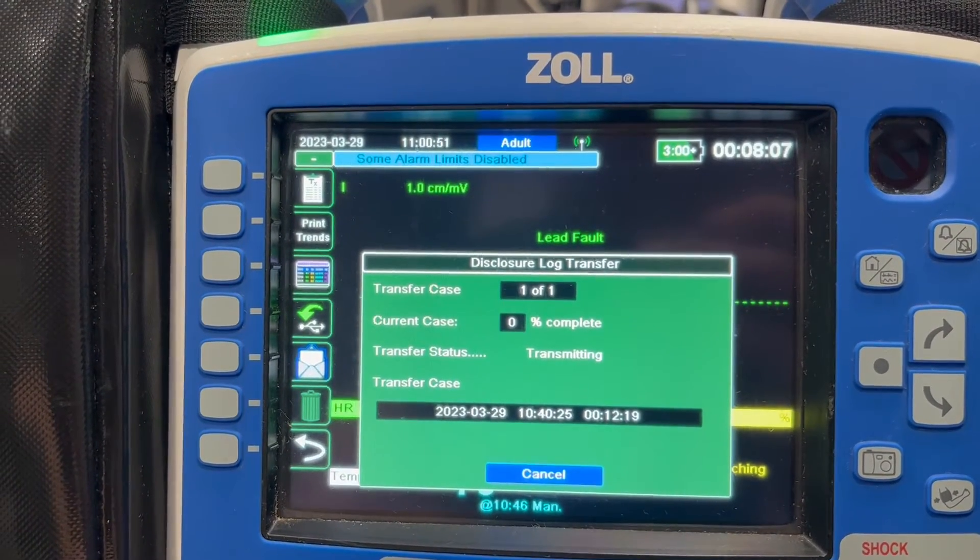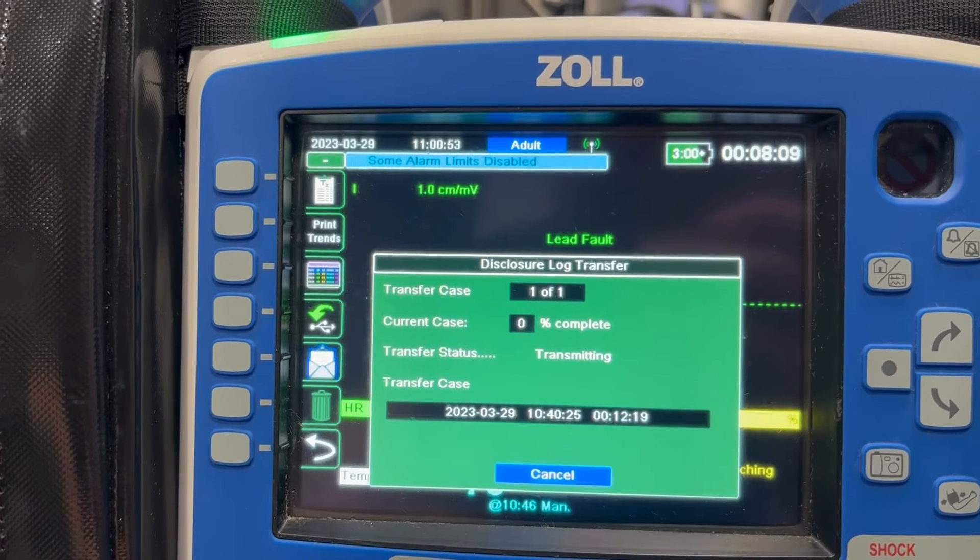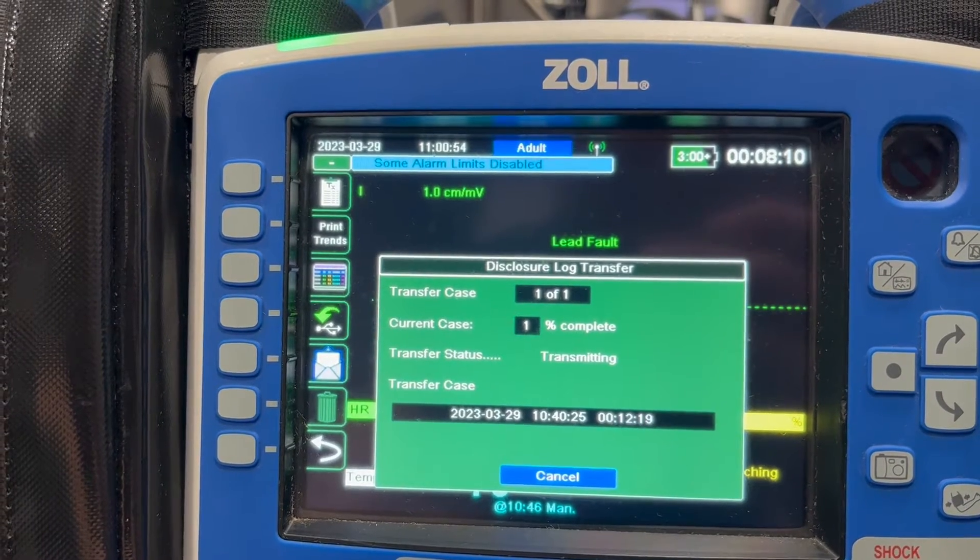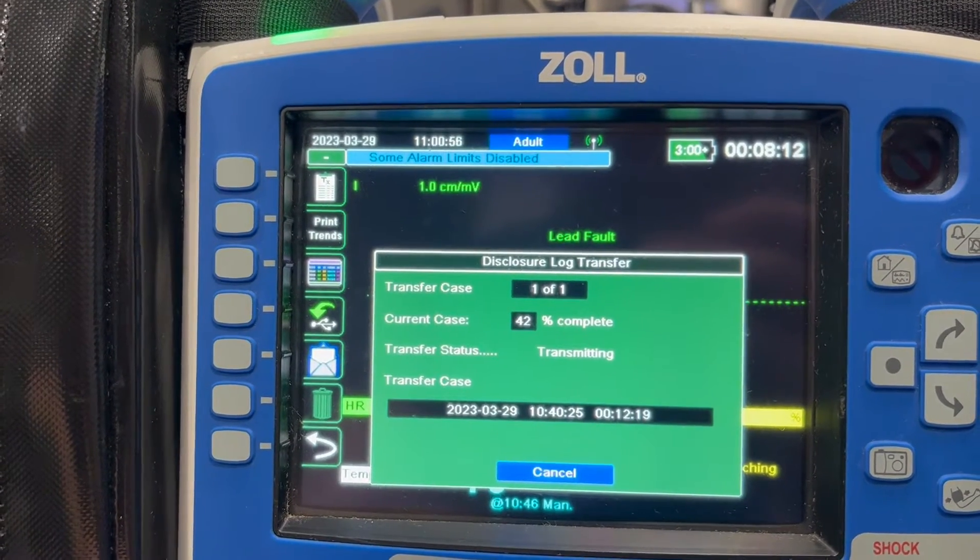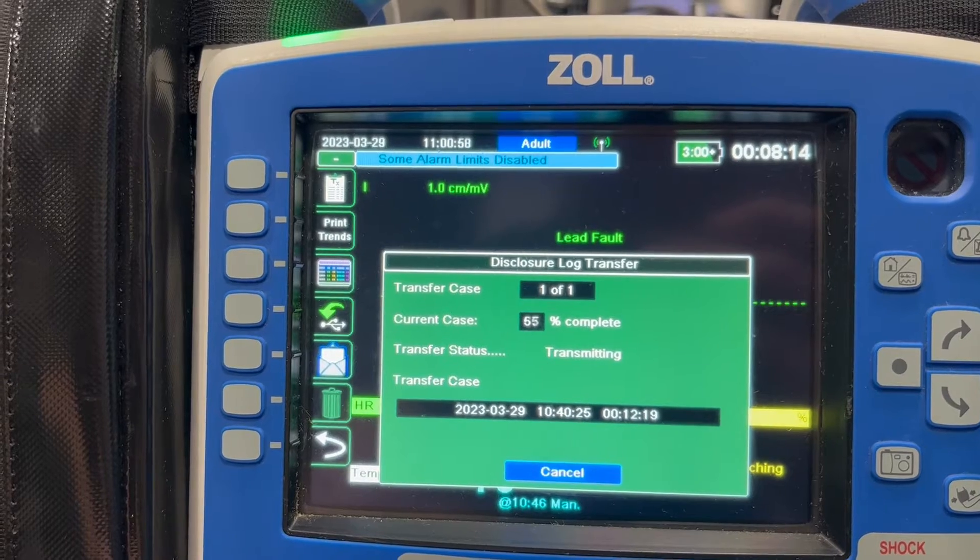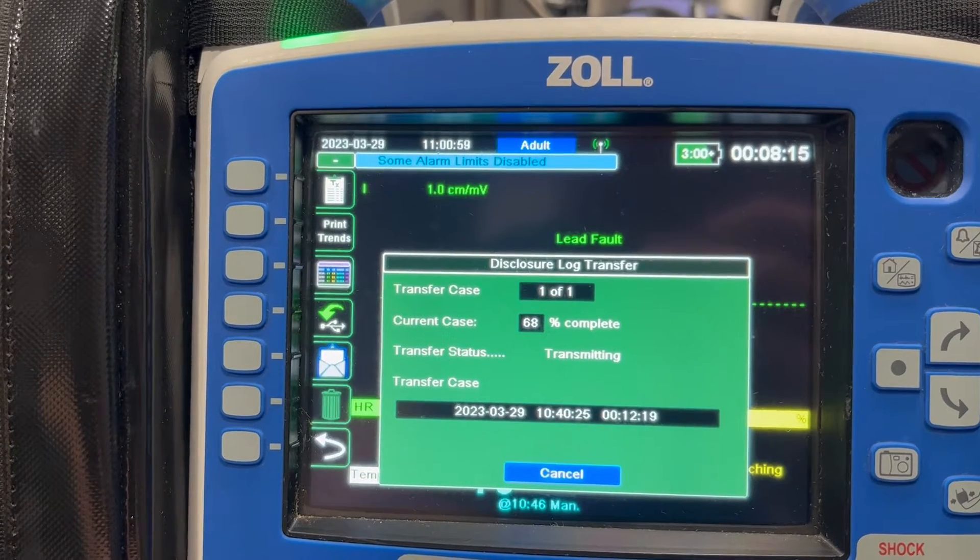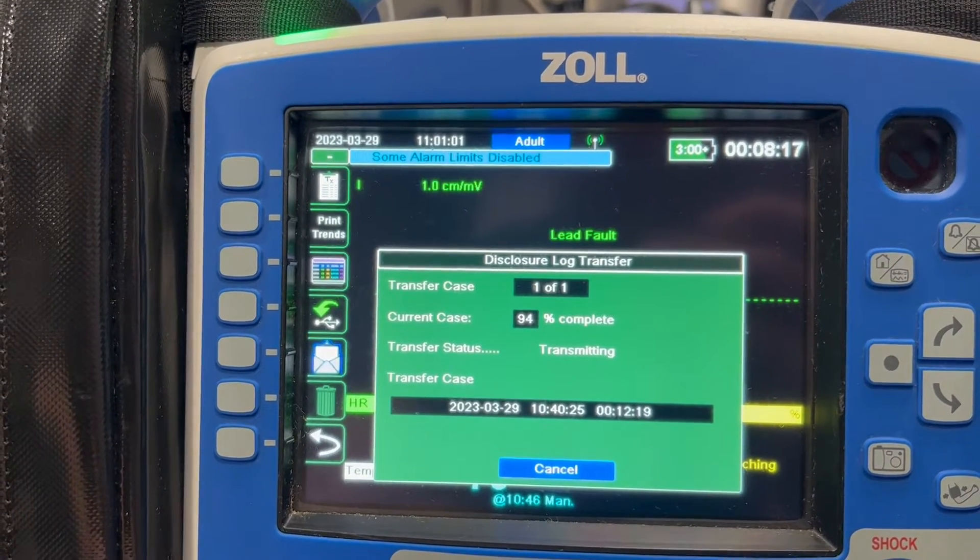You'll see a little progress screen come up here. You got to be connected to Wi-Fi to do this, which you will be in the back of the ambulance, and then it'll send off to the hospital and be available in your EPCR, which is the next step that we'll show you here in a second.